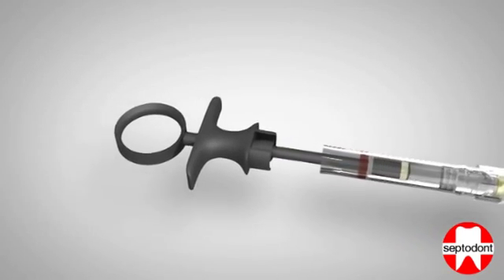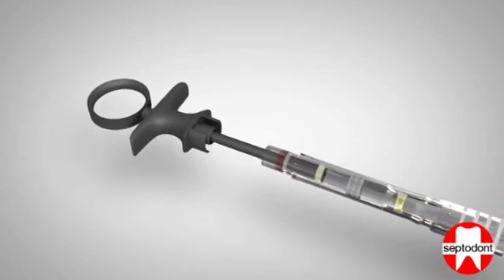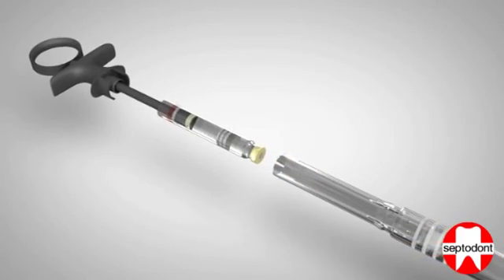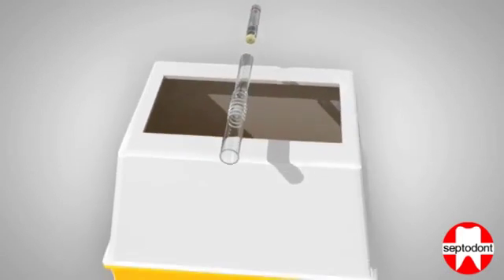Now partially insert the tip of the plunger into the open end of the cartridge, and then withdraw the plunger with cartridge attached from the device. Now the injection device can be disposed of safely.